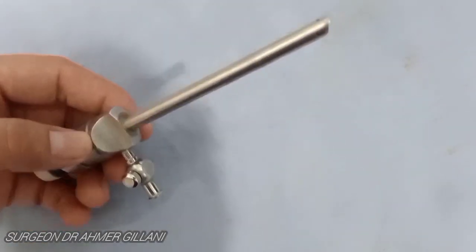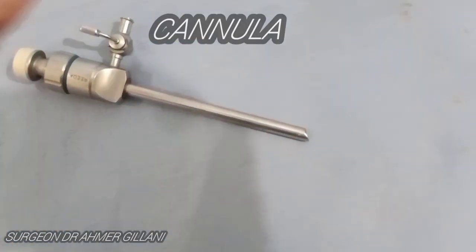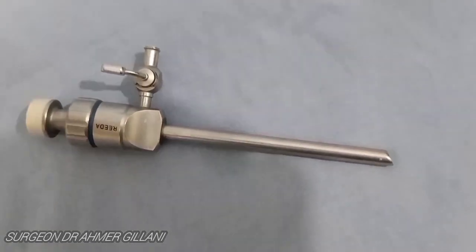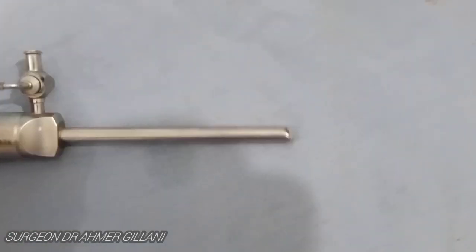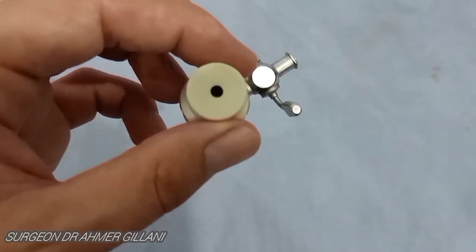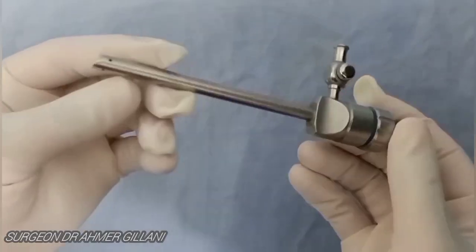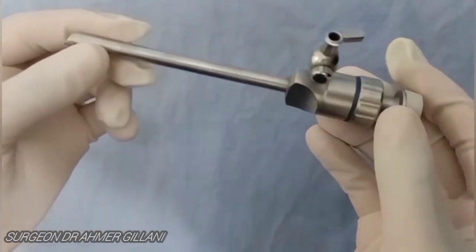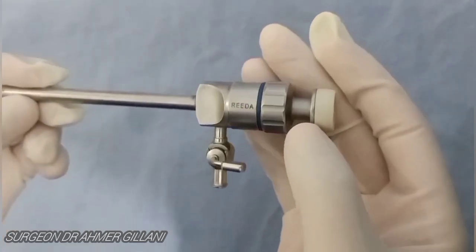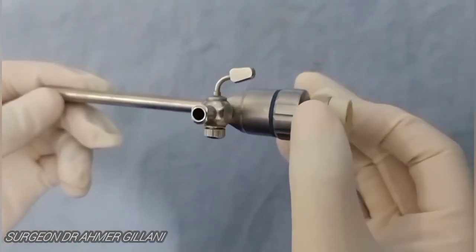Now you are seeing the ports. There are various sizes of ports — most commonly the 5 mm port, 10 mm port, and the 15 mm or 12 mm port. There are two types of ports: one is without reducer and the other is with reducer. This is the port without the reducer; in the next instrument I will show you the port with the reducer.